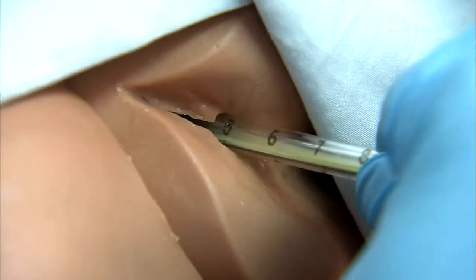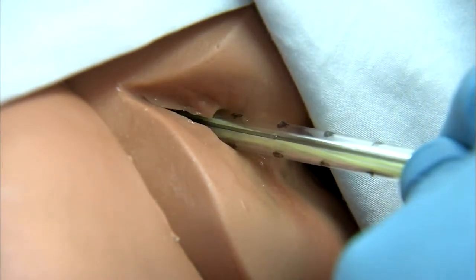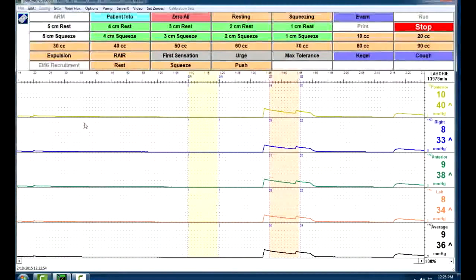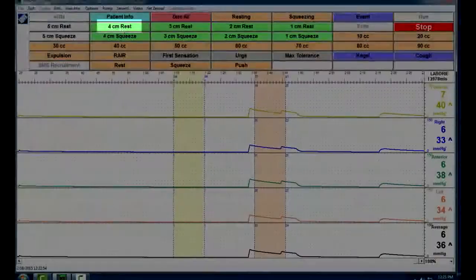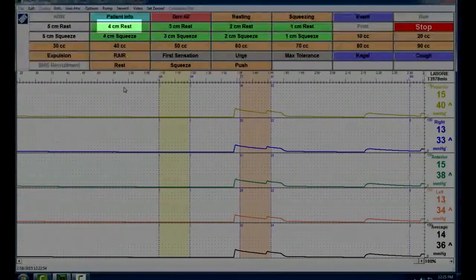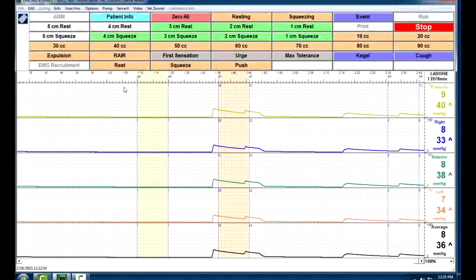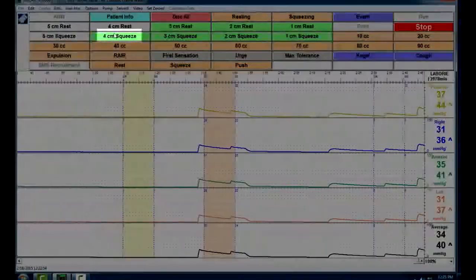Because what we're going to do now is pull the catheter out to the 4 centimeter mark. At that point, the pressures should go a little bit higher because we're getting farther into the anal sphincter. Once you're at the 4 centimeter mark, again, somebody is holding it so it doesn't migrate in and out, and we have the black line towards the spine. Then we're going to click the 4 centimeter mark, and you can see that it continues to flash there on our screen. And then once that's done, you're going to ask the patient to squeeze.